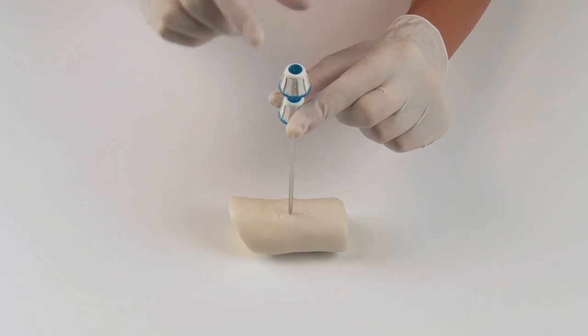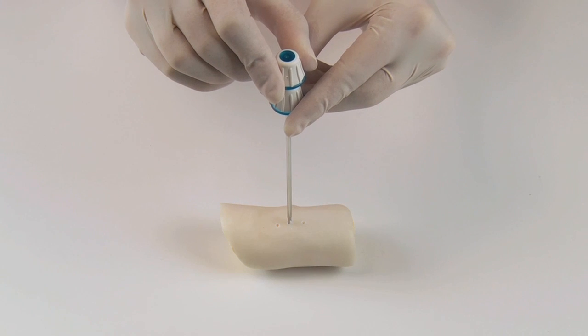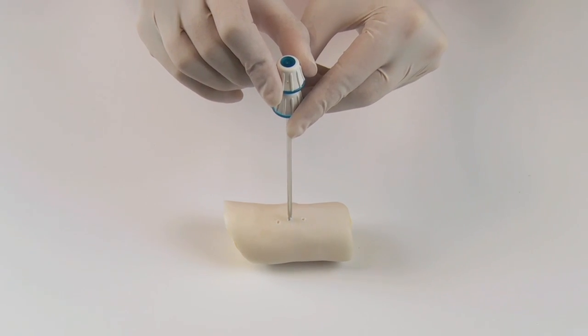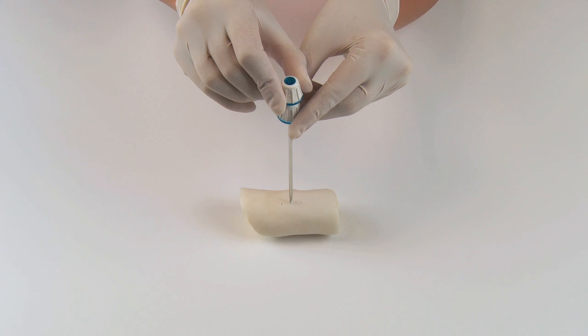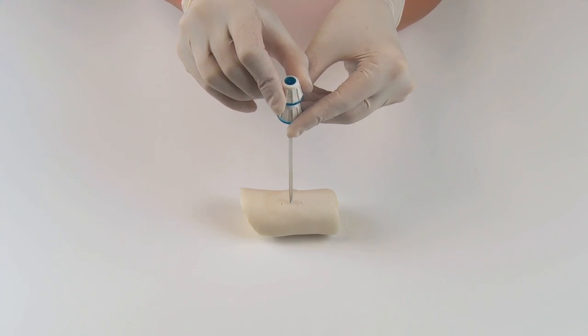Before drilling further, retract the penetration cannula to allow the wobbling movement of the eccentric drill. From an engineering standpoint, retracting the cannula exposes the eccentric drill bit, which allows the drill to make a hole that is larger than the cannula itself.